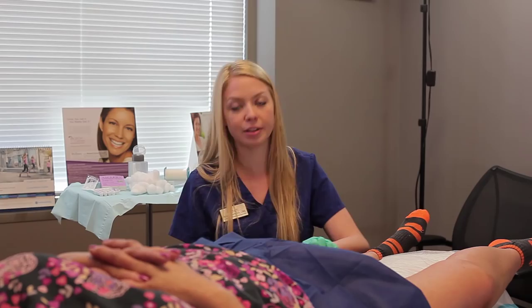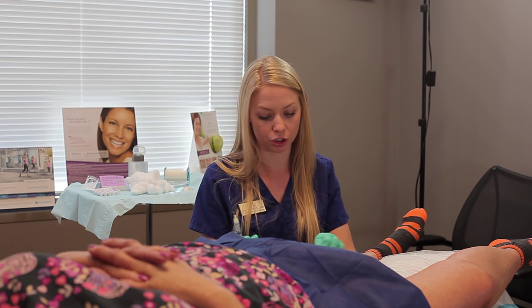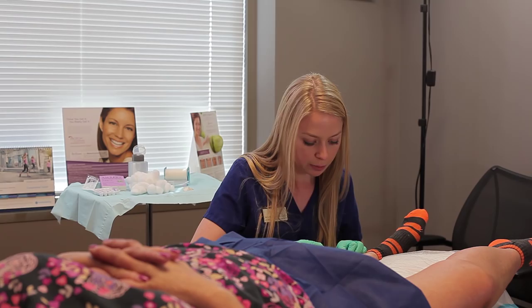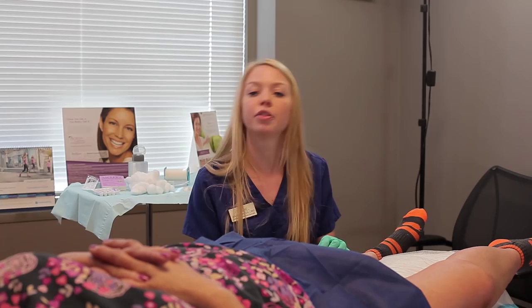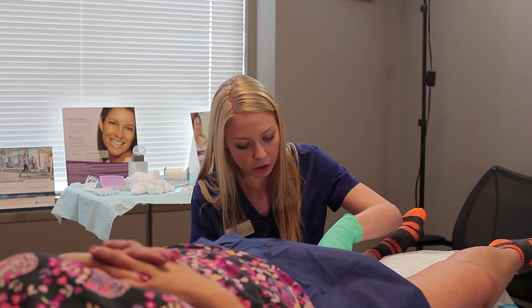While three to five sessions is an average amount, some people respond very well after just one or two. Spider vein treatments, a lot of the time, is a maintenance thing unfortunately. So the spider veins that we treat today may go away completely, some of them might come back over time, and some of them may never come back.